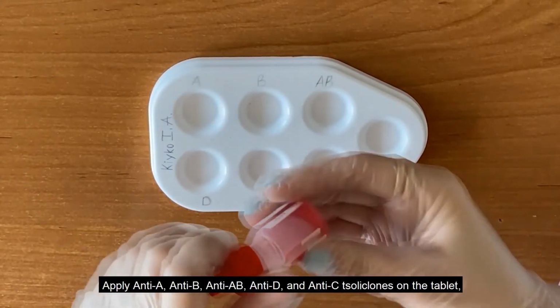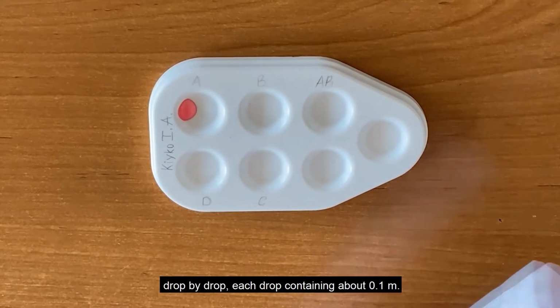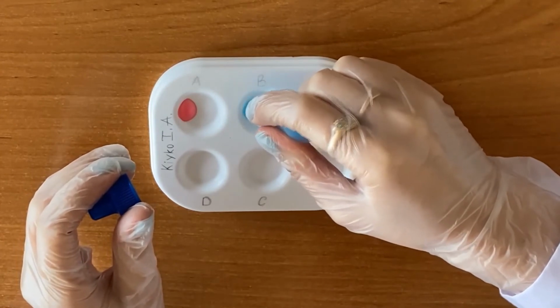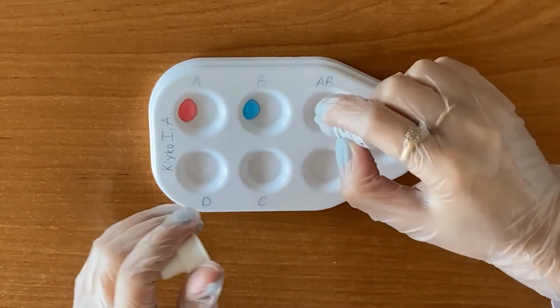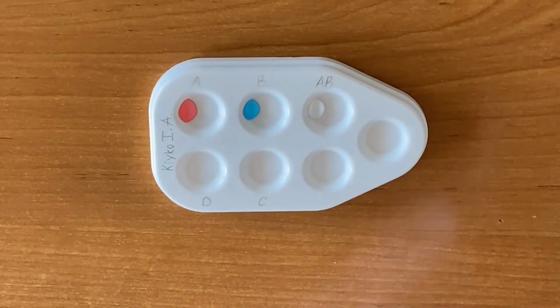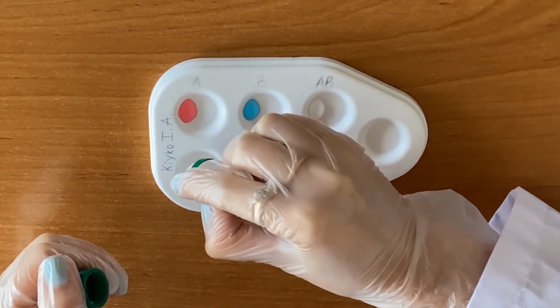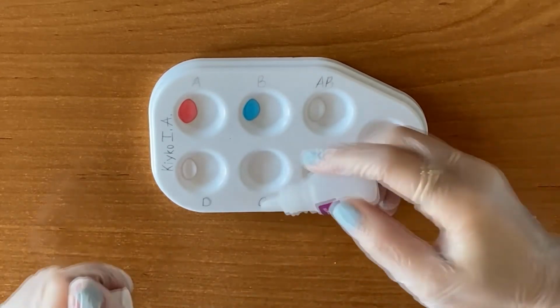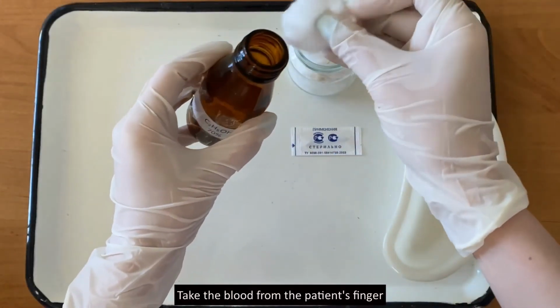Apply anti-A, anti-B, anti-AB, anti-D, and anti-C clones on the tablet drop by drop, each drop containing about 0.1 milliliter. Take the blood from the patient's finger.